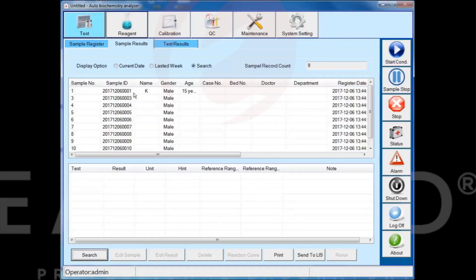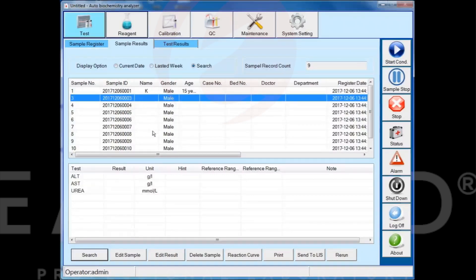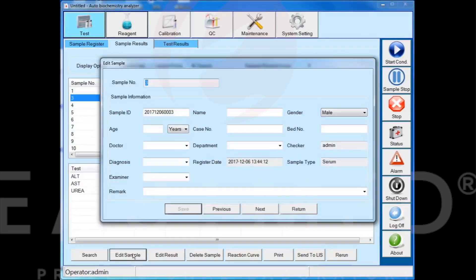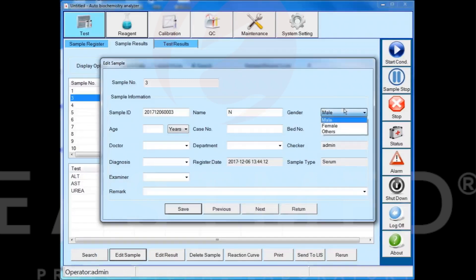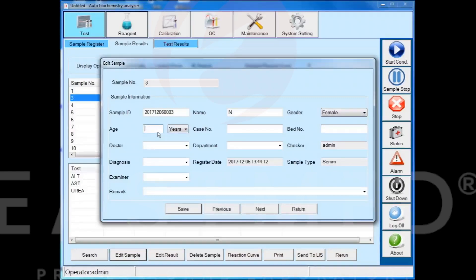Select the sample information and click the edit sample button to edit it. All boxes with a black drop-down arrow can be added in the system settings as a diagnosis interface.